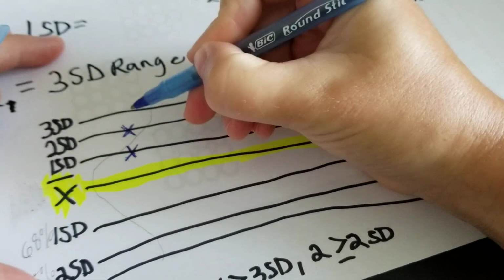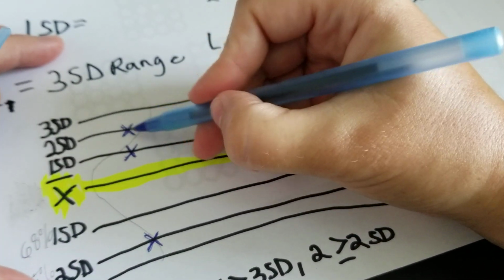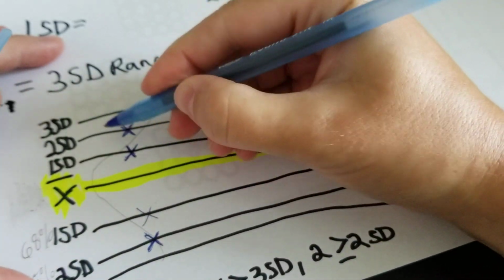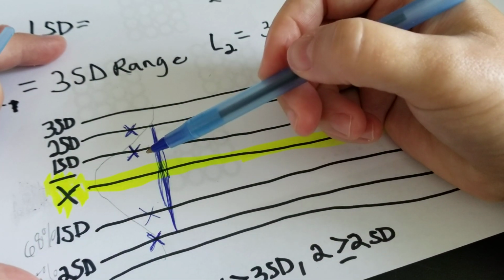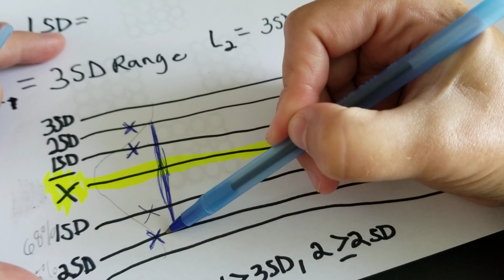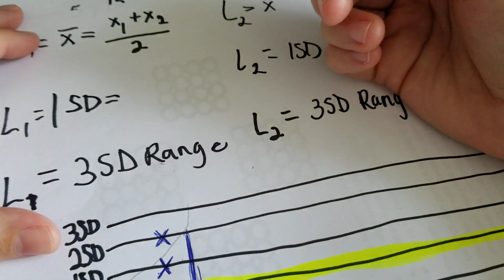The 2 SD line on top and the 2 SD line on bottom, standard deviation. But notice how many lines are there away from the mean in that range. So we're doing this range right here. How many lines are there? There's 1, 2, 3, 4 within that range away from the mean, right? So knowing that, we want to make sure that we put that into our calculation.